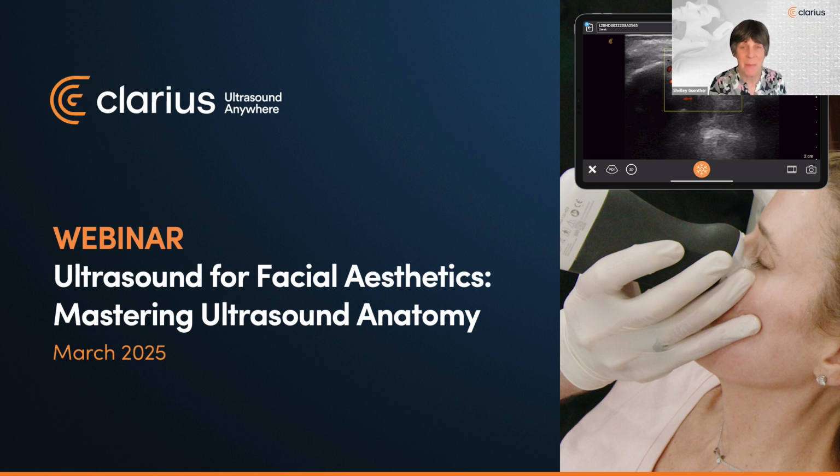We're excited to see so many of you join us here today for the live webinar titled Ultrasound for Facial Aesthetics, Mastering Ultrasound Anatomy. And by popular demand, renowned facial plastic surgeon Dr. Stephen Weiner will be describing facial ultrasound anatomy as it relates to facial injections.